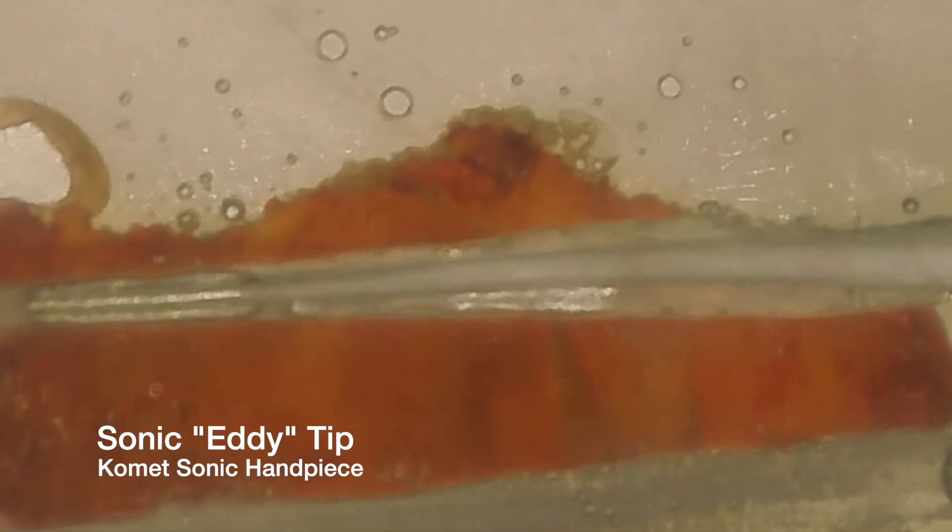The eddy tip is stirring the solutions, activating them.